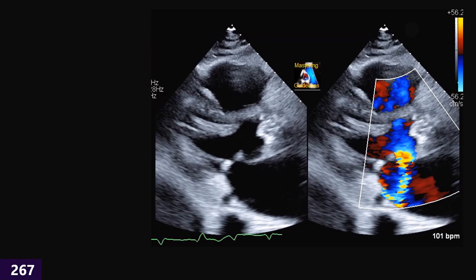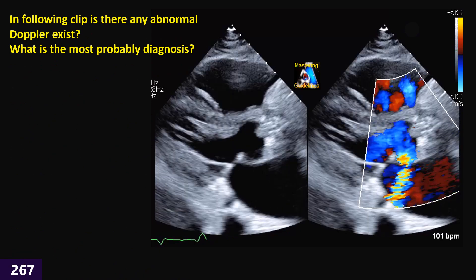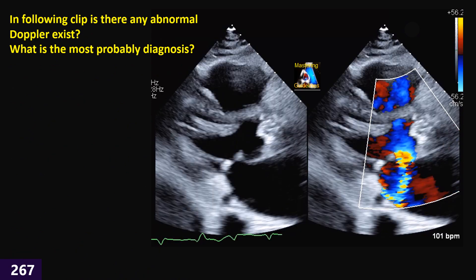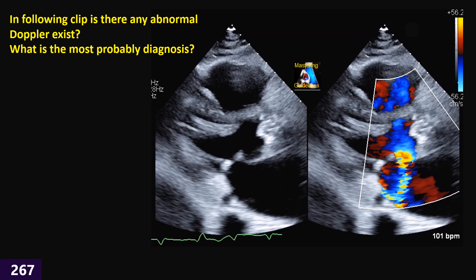Here we have another case based on the color Doppler and 2D. We have two views — name them. Do you see any abnormal color Doppler? If yes, what abnormal Doppler can you see and what do you call it? Is it one or two — it's up to you. What is the most probable diagnosis? And besides that, do you see any other abnormal finding on 2D?